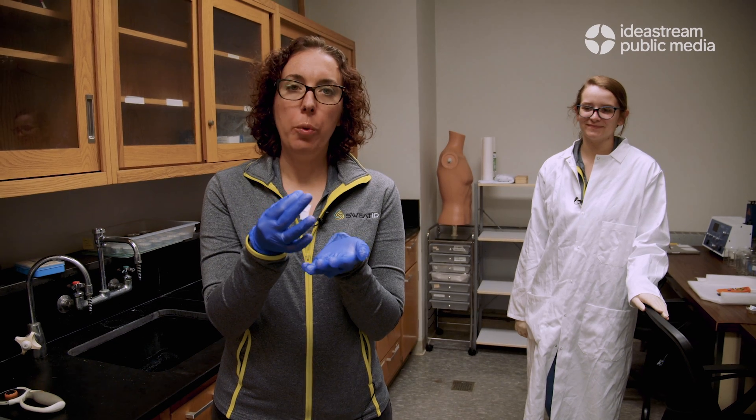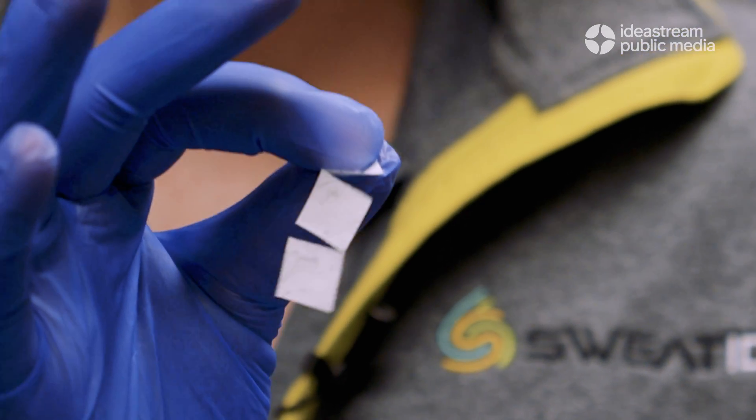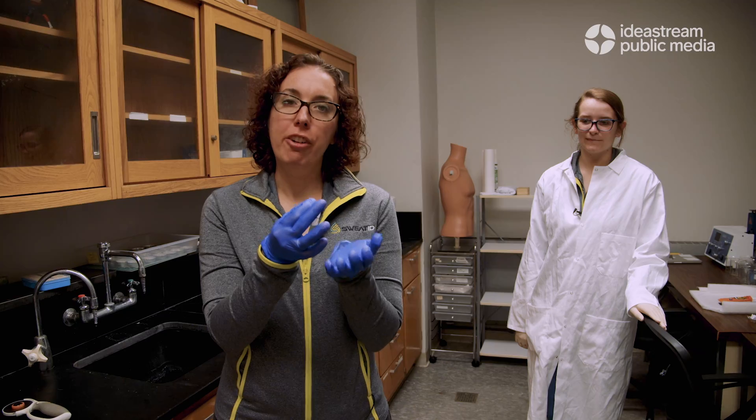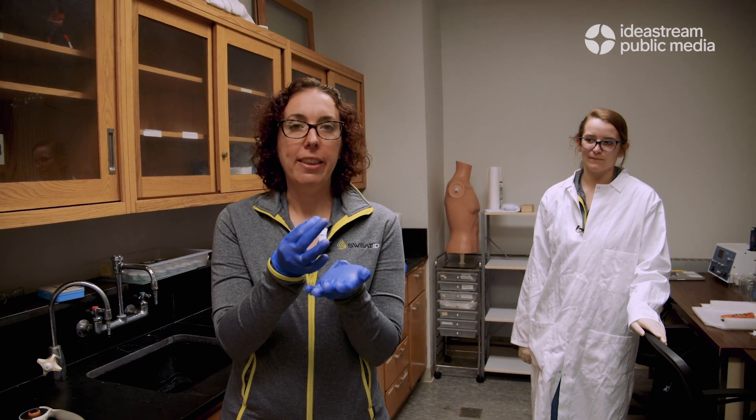After we make the non-woven nylon mat, we cut it into small squares, make it conductive, and then add a functionalization to grab the sodium from the sweat so we can selectively measure sodium while our athletes are sweating.